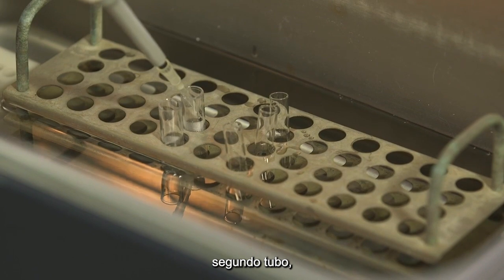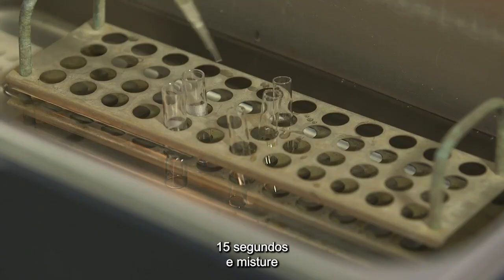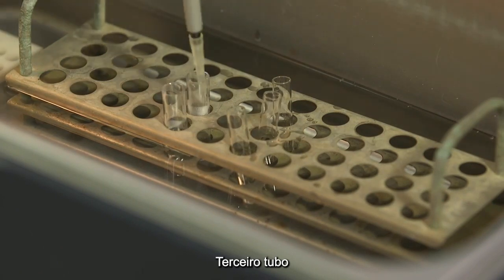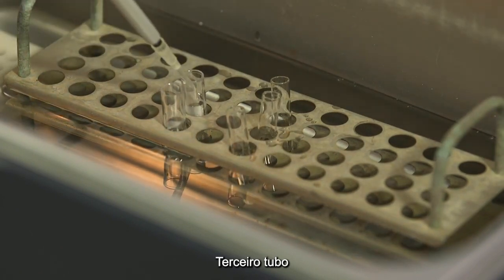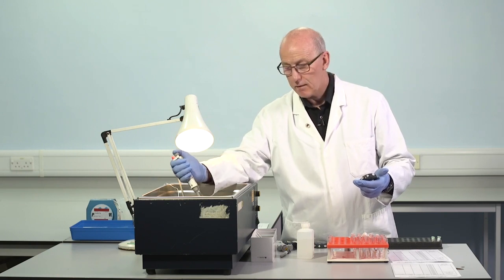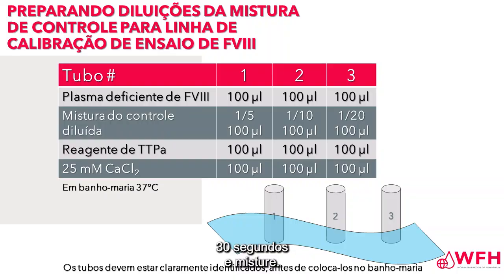Second tube, 15 seconds and mix. Third tube, 30 seconds and mix. So we've added APTT reagent, activator, phospholipid.